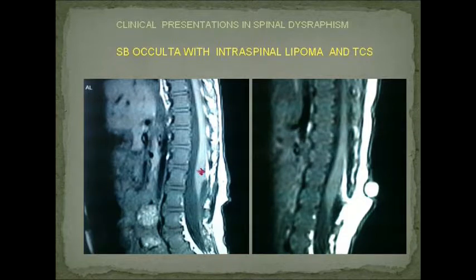Another small intraspinal lesion, a little lipoma at the back, but you have a little tethering, and again a tongue of a lipoma going and licking the cauda equina. Probably requires no neurosurgical intervention. May require urinary workup for sure. Again, whether baseline or not, we don't know.